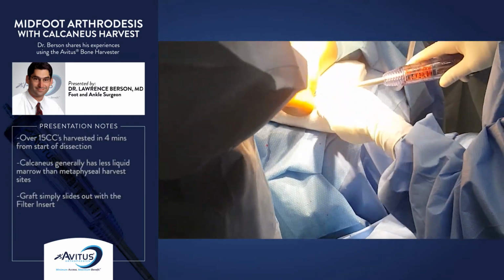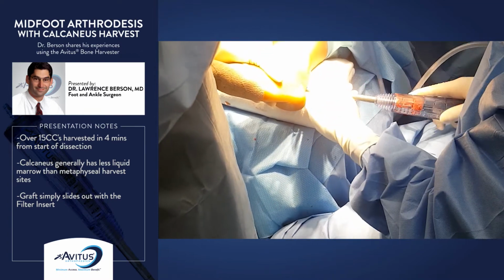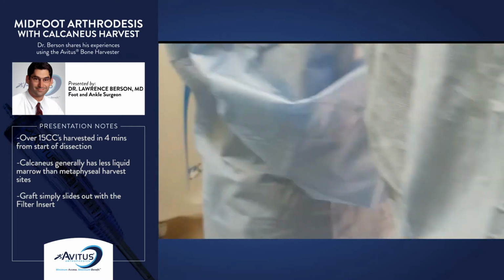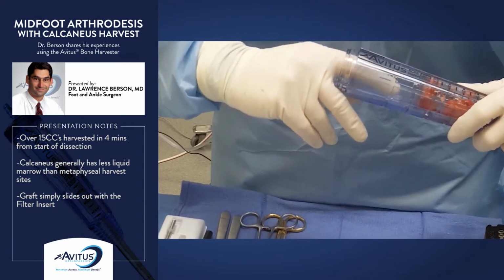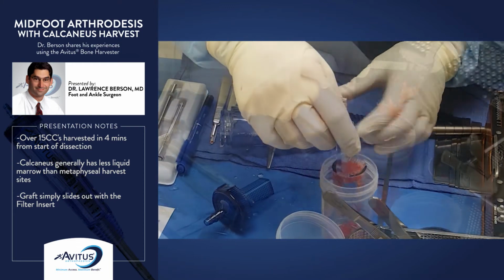Okay, at that point, I think we had adequate graft. Pass it off the field. We just have my assistant in the back table remove the bone graft from the device and then just hand it to me on the field to pack it in with a forceps. And here's our graft on the back table. I think we got at least 15 cc's in this case, which was more than adequate for this patient.